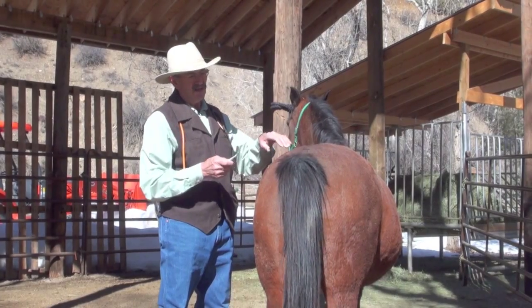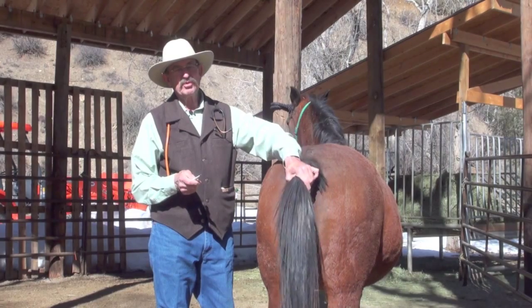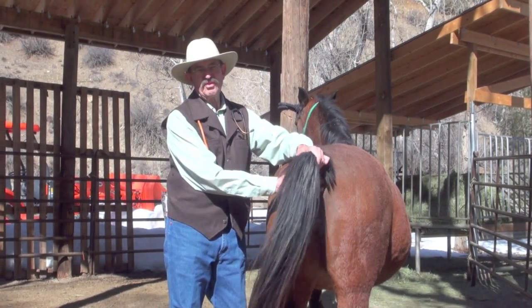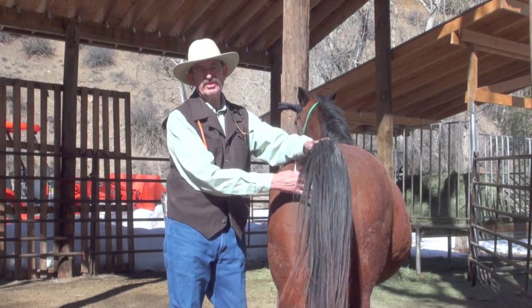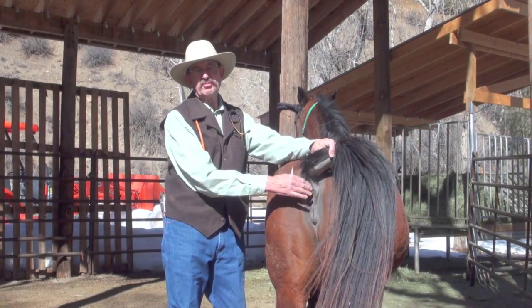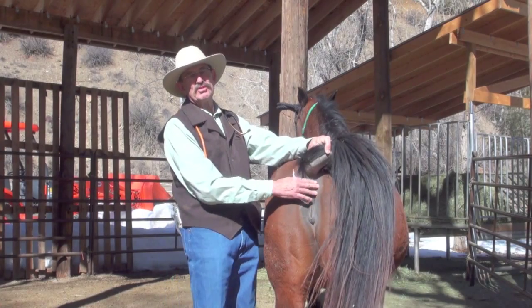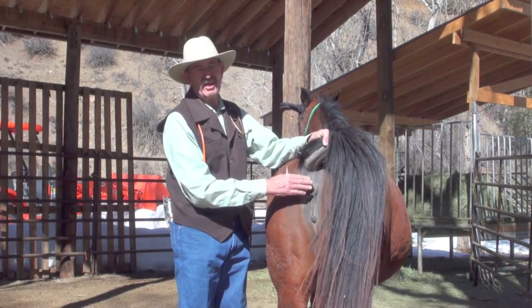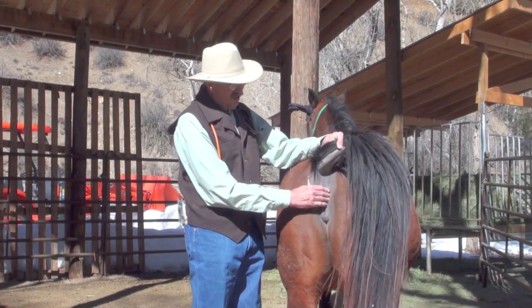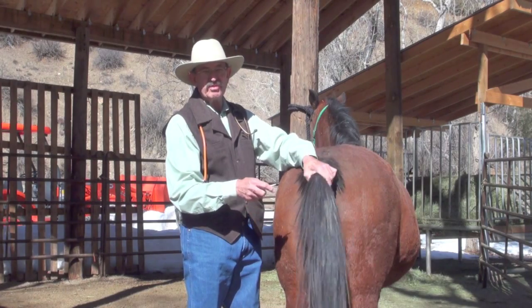Now horses that are not used to that, often times you have to lift the tail, and if you will lift it up two or three times and let them know that you're back here, reach across with one hand and touch the area just above the anus. In doing so, you let them know that you're going to be there and you're going to be doing something. The other thing that's useful about this is that it gives you a chance to examine this area and find out if it's dirty, if there are any sort of lacerations or discharge that might be of interest to you or to your veterinarian.